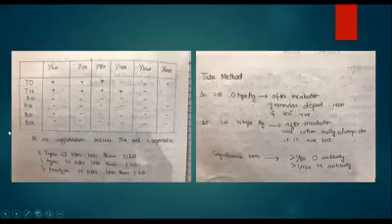So here again you can see the test. This is one positive test, in which you can see that the positive signs show agglutination. For O antigen, all these dilutions have shown some agglutination. So 1:80 is the titer, and compared with the significant titer, which is 1:80, this is going to be positive. For H antigen, again these are the positive agglutinations, and the titer is this one, 1:160. Comparing it with the significant titer, again this is positive. So this report is positive for typhoid fever.